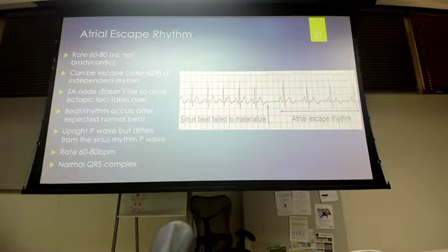I mean, you might, if you're really good at EKGs, you might be able to figure out that the subtlety is in the P wave and how the P wave presents. But the reason I tell you that is don't expect to see that on your exam either. I'm not going to ask, hey, is this an atrial rate or is it a normal sinus? I'm not going to give that to you because in real life you may not be able to pick that out.